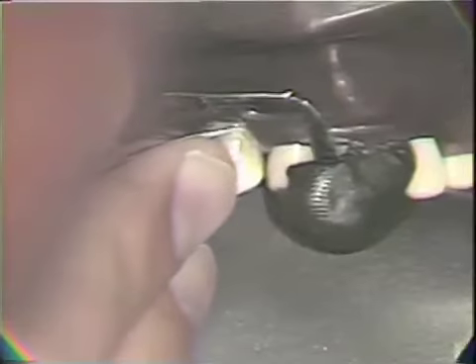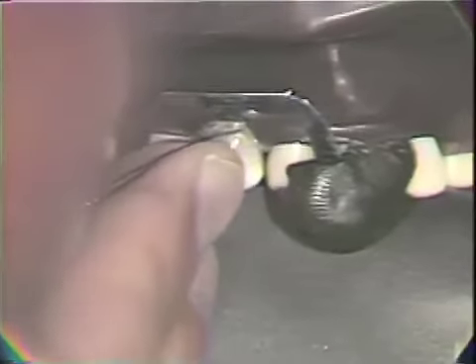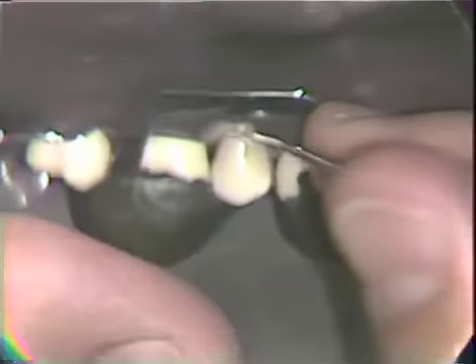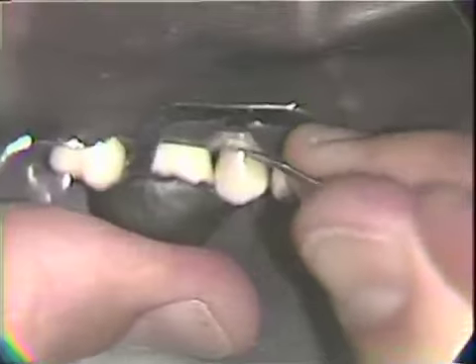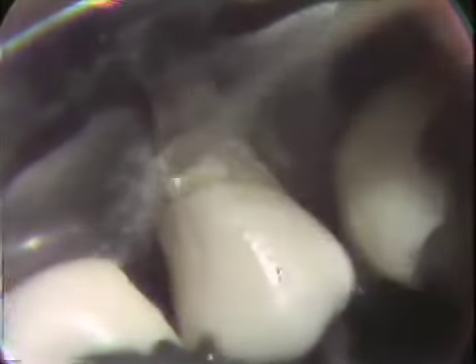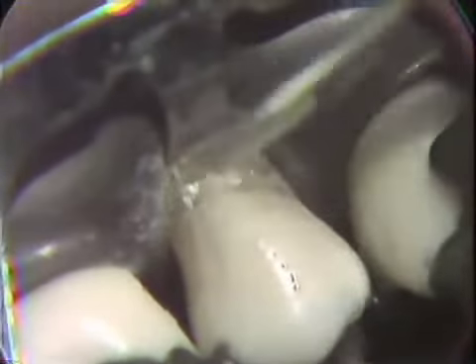It's also convenient from the standpoint of finishing. Once we find that straight line, it makes finishing then an easier task, really, to follow that. Making sure that we are smooth and regular in outline form.